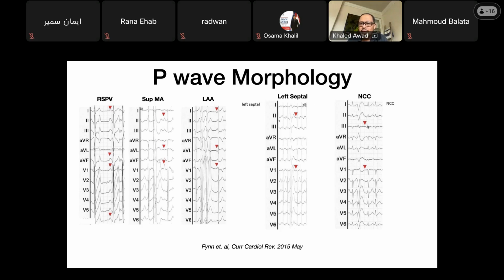The non-coronary cusp is something you will experience every once in a while. There's quite a bit of those. I think a lot of what we call non-coronary cusp atrial tachycardias are honestly just left atrial tachycardias arising from the left atrial side of the septum behind the non-coronary cusp. And that makes sense because the non-coronary cusp itself is fibrous tissue. There's no atrial or ventricular tissue inside the cusp itself. Why do we ablate them there?